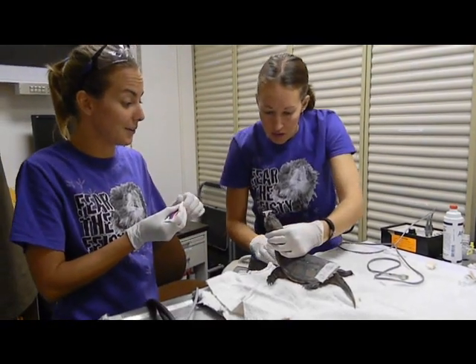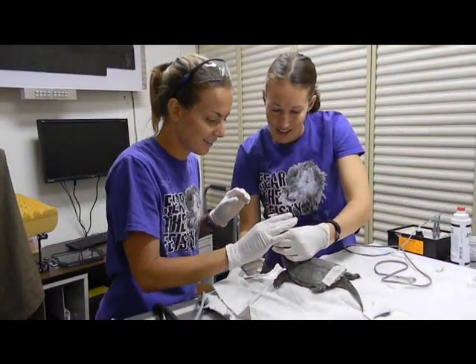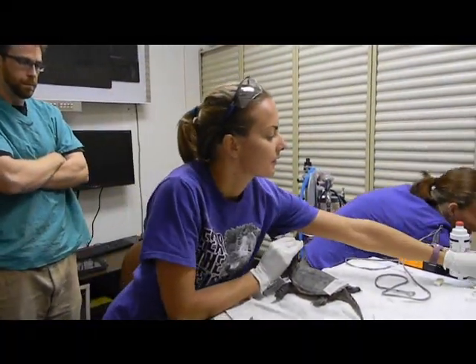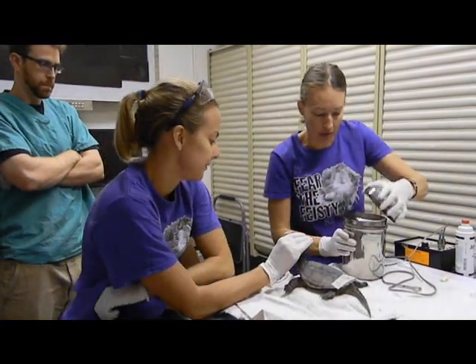He was like crawling up the table last time. He says it just is going to feel weird. Okay, let me just clean that up really fast.